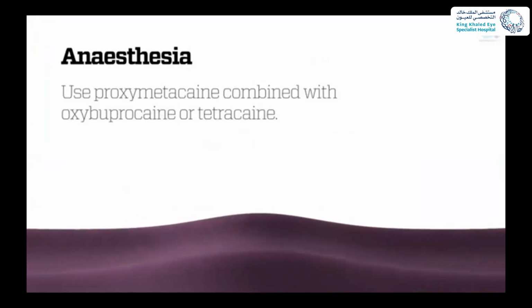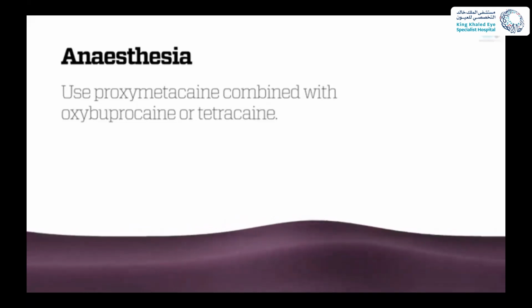Generally, I use proparacaine and then something else, so oxybuprocaine or tetracaine. Look up to the ceiling, please.